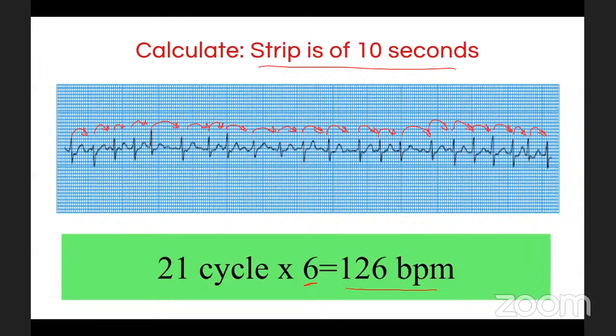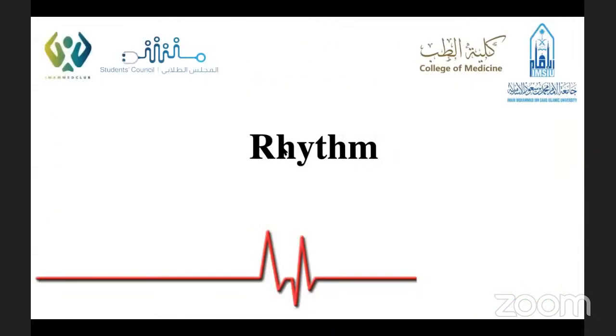بس حطيتها توضيح إنه ممكن، الميثود اسمها 6 second strip method، بس ممكن بدال 6 second strip يعطينا 10 second strip. فبس أعكس بدل ما أضرب ب10 أضرب ب6. يا رب إنه واضح. أوكي next. الحين خلص كيف نحسب الريت. راح الفور ويز إن شاء الله إنهم كانوا واضحين.